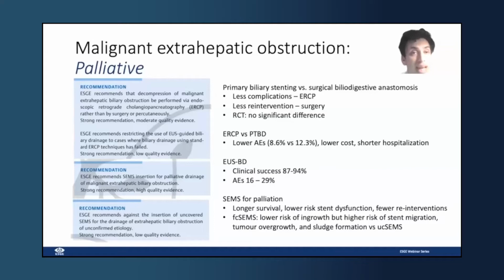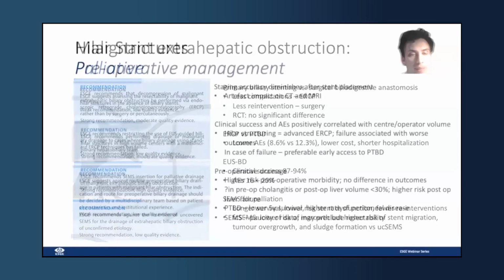Now, crucially, if there is unclear etiology as to what the disease is, ESGE does not recommend the use of uncovered SEMS because in general they cannot be removed and are associated with long-term morbidity and mortality if inappropriately sited and subsequently proved not to have cancer.